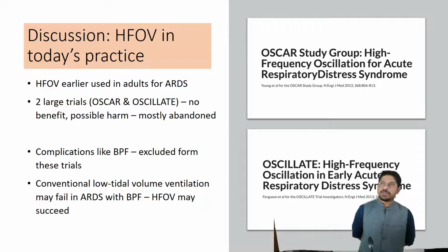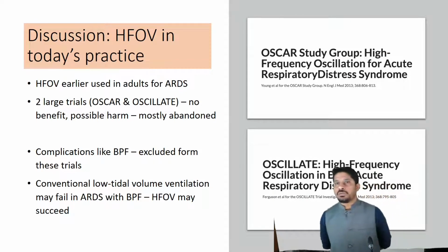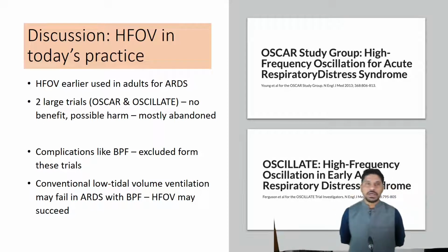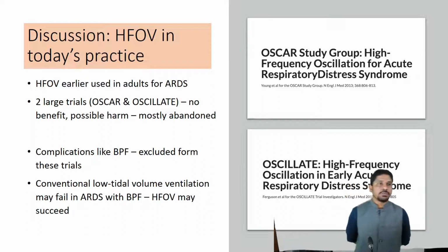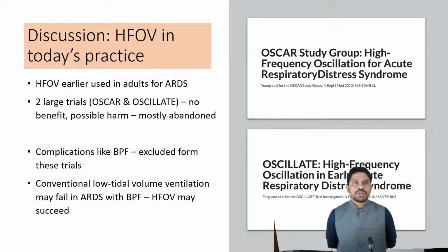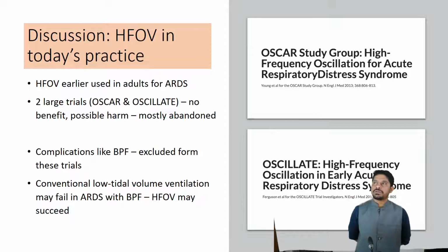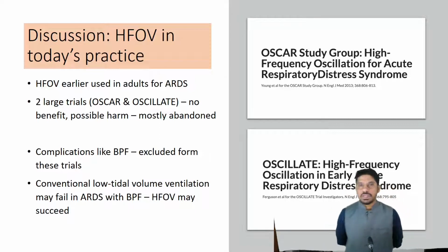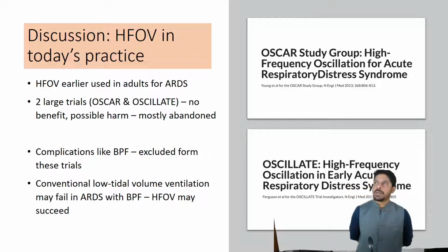HFOV in today's adult practice is almost archaic or not used very frequently. Earlier, it was used in adults with ARDS. However, two large trials in 2013, the OSCAR trial and the OSCILLATE trial, showed that compared to normal low tidal volume ventilation, HFOV does not offer any benefit, or rather, it could increase mortality. And so, mostly in adult practice, HFOV has been abandoned.